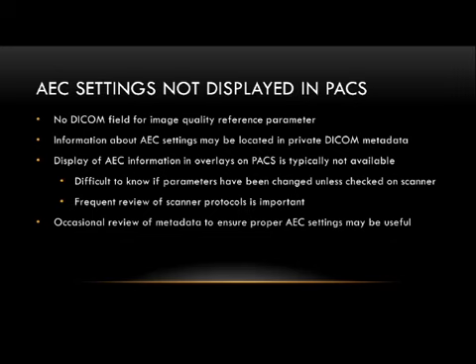I don't know how, but there are ghosts in the machines. They'll tell you, I don't know how this parameter got changed, but it got changed, whether it gets blamed on the service guy coming in, or it was just changed for one patient and never changed back. Things do end up changing, and we could be completely unaware of them because these parameters aren't available for easy review.